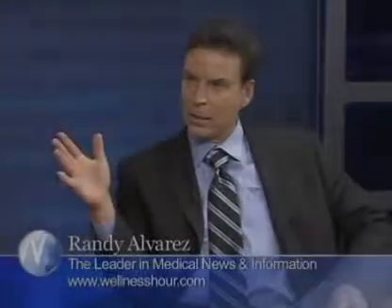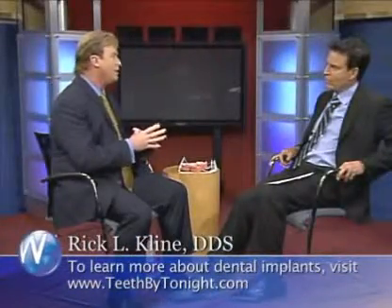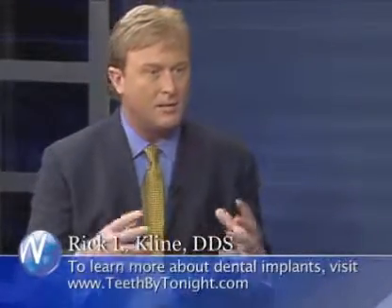Any changes in the world of dental implants? Randy, a lot of changes. And we're no longer using just regular dental x-rays to plan our dental implant procedures. With regular x-rays, we can only see the bone in 2 dimensions. And that usually involved making large incisions and a lot of downtime. And today, with the CAT scan, I can see the bone in 3 dimensions and even inside the bone.